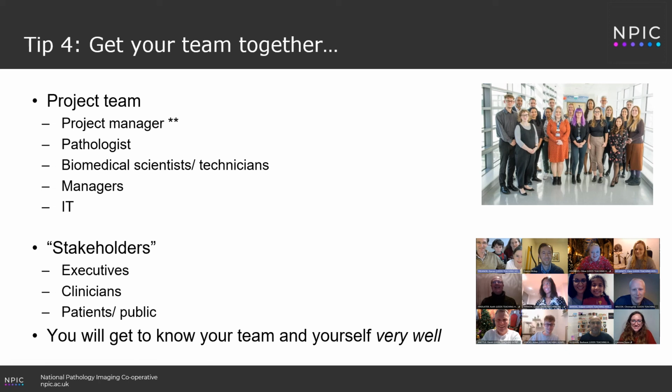On NPIC, we have a team of over 8 project managers at the moment. You need a pathologist to lead the program clinically, but also pathologists to be engaged with the program. Biomedical scientists and technicians who are going to undertake that substantial change in the laboratory, pathology managers, and of course the input of your IT department from the early stages.